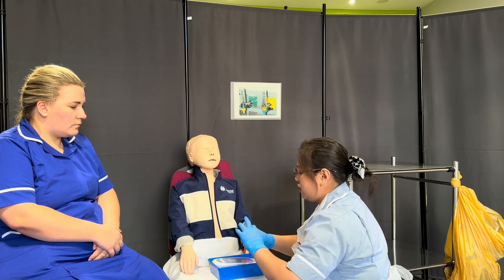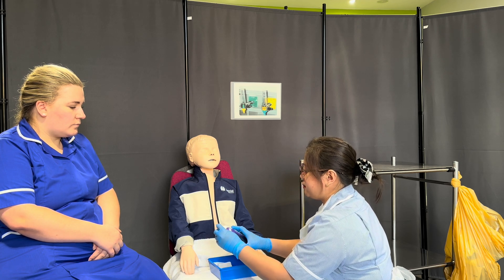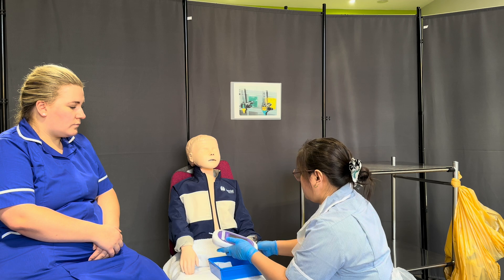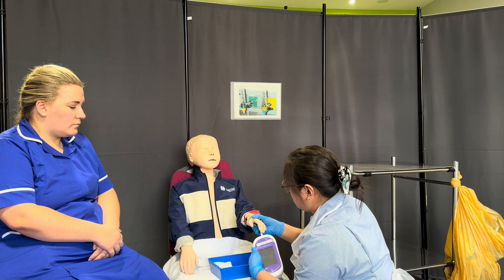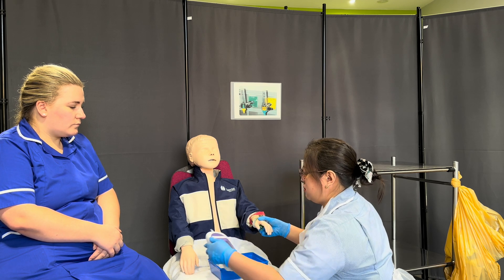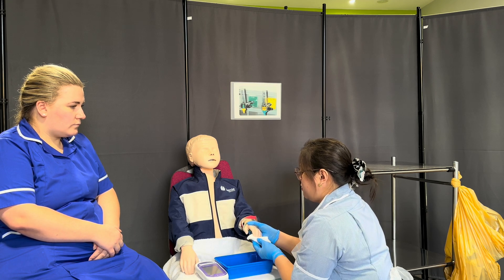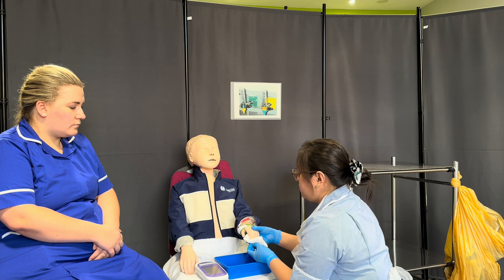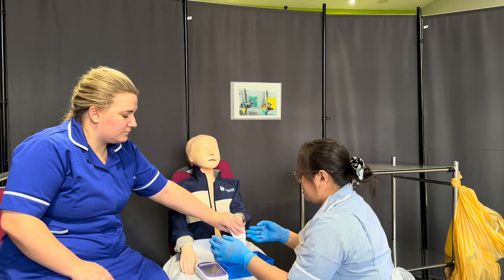Okay, so I'm going to put the test strip into the glucometer — it's working. I'm going to draw blood from Mary's finger, making sure that the test strip window is fully covered with blood. Okay, that's fine. I'm going to apply pressure on the finger. Mary, can you apply pressure on your finger for just a couple of seconds? Thank you.